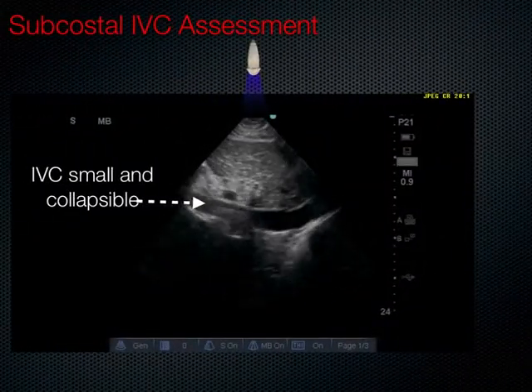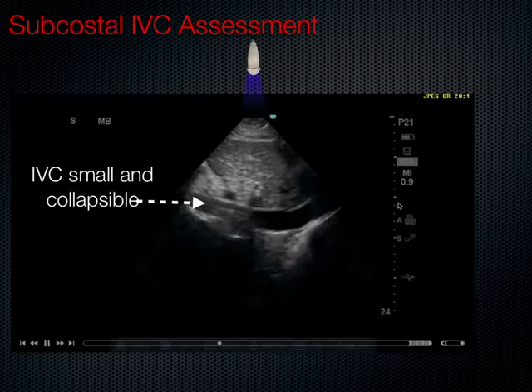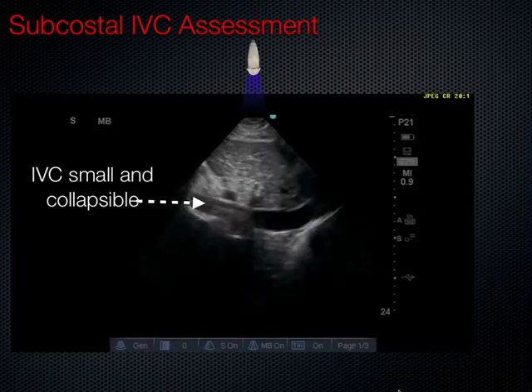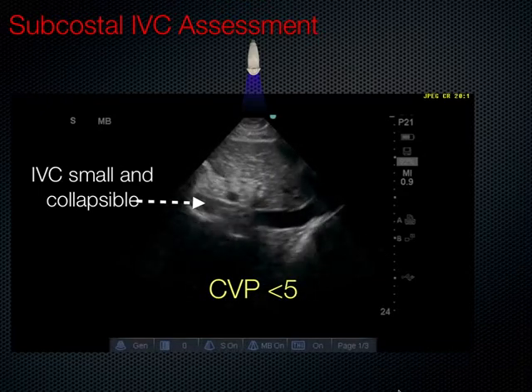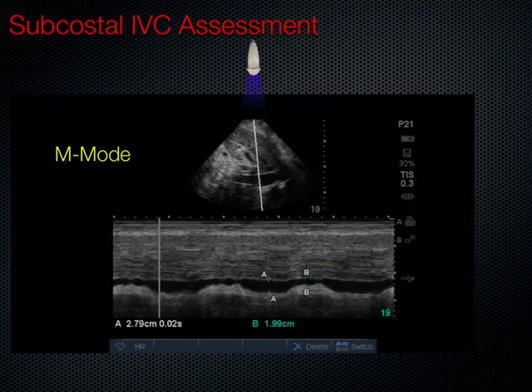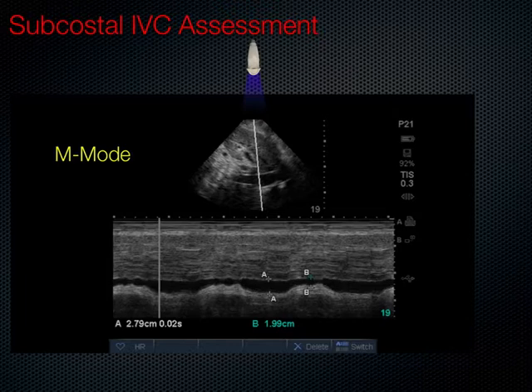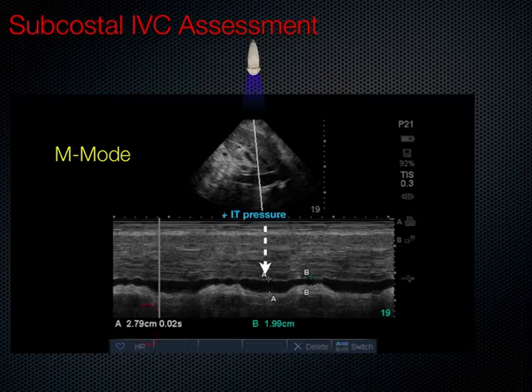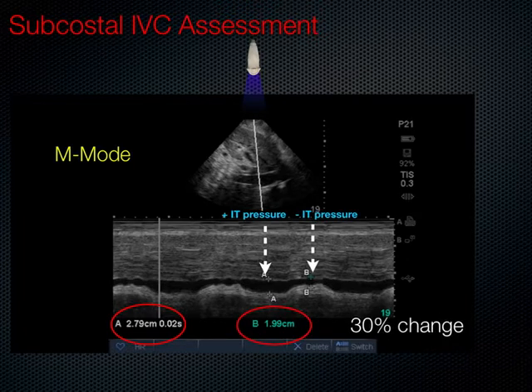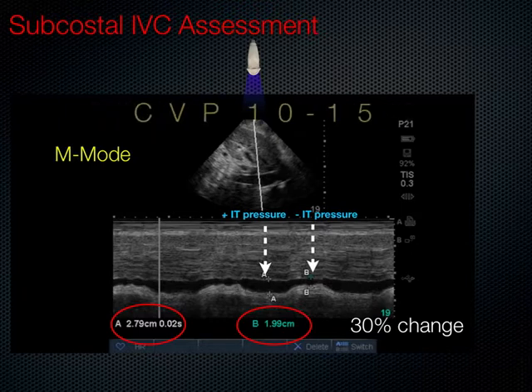Here we have an inferior vena cava that is small and collapsible. Using the centimeter marks on the side of the screen for scale, you can see that with respirations this IVC is almost completely collapsing, representing a CVP less than 5. In a hypotensive patient in the right situation, that patient would be responsive to fluids. We can also place an M-mode line through the IVC — motion mode records everything along that line over several seconds. You can freeze the picture and measure with calipers at maximum diameter during positive intrathoracic pressure and minimum diameter during relatively negative intrathoracic pressure. In this case, approximately 30% change with an IVC greater than 2 cm represents a CVP of 10 to 15.